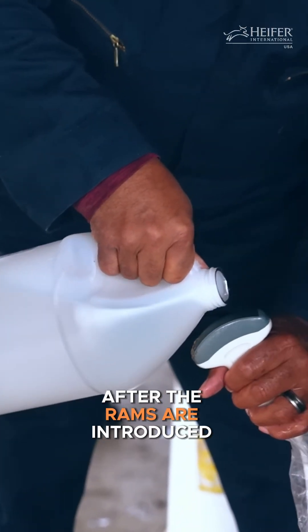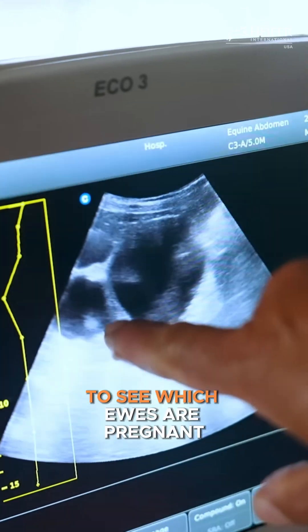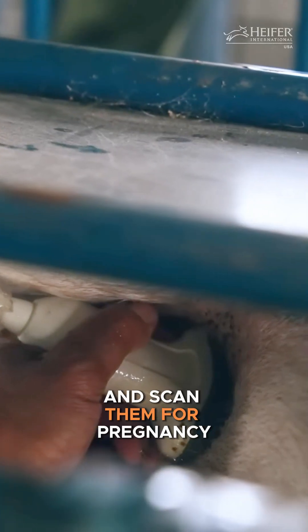About 60 days after the rams are introduced for breeding, we will conduct ultrasounds to see which ewes are pregnant. We'll run the ewes through the corral, catch each ewe in the squeeze chute, and scan them for pregnancy.